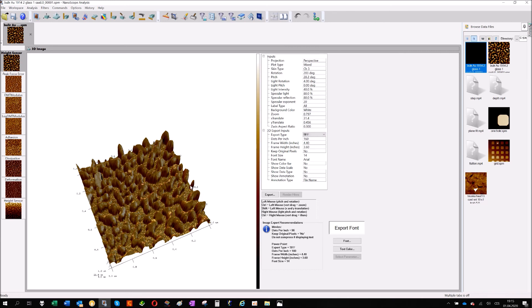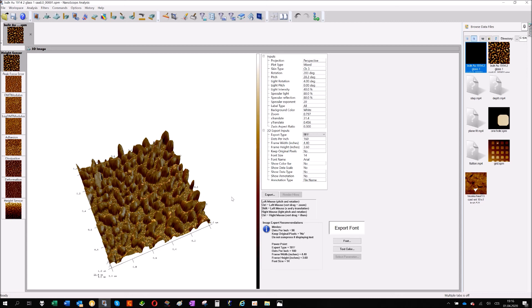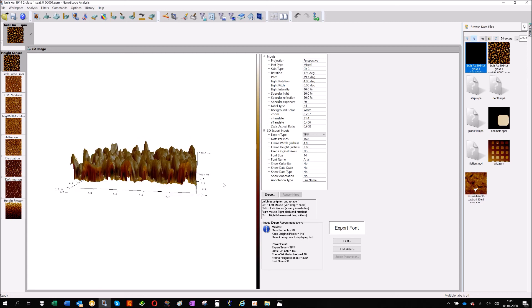Information about the sizes. If you want to have a color scale bar, scale bar describing the colors, or something. What should be the font size, and then click export. That's it. Two ways how to export the data from AFM images: one for 2D and second one for 3D images.